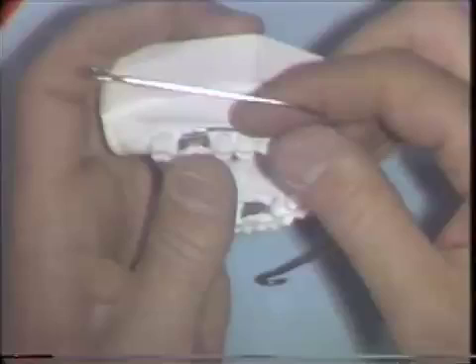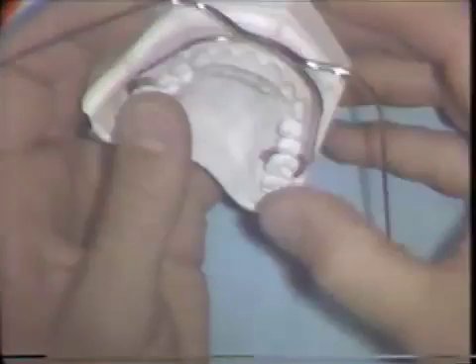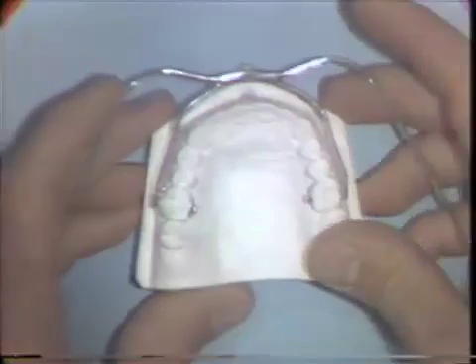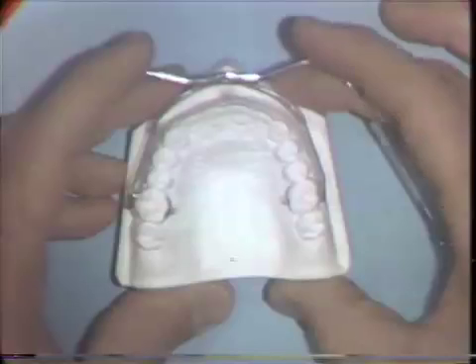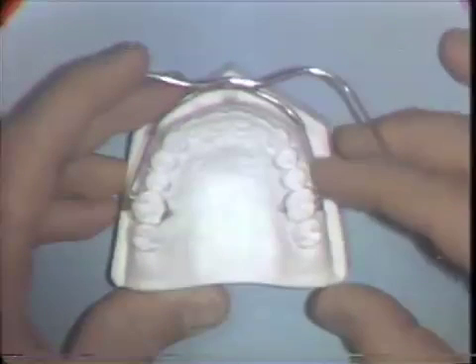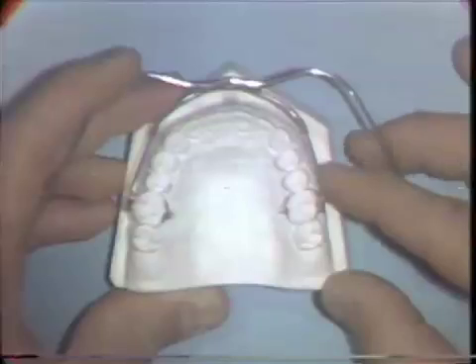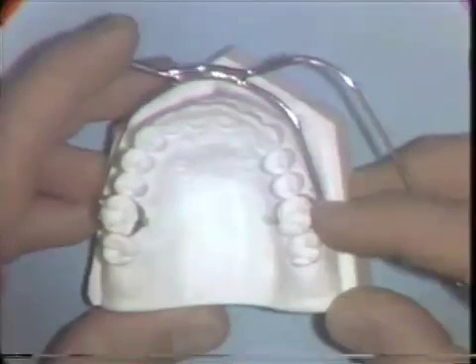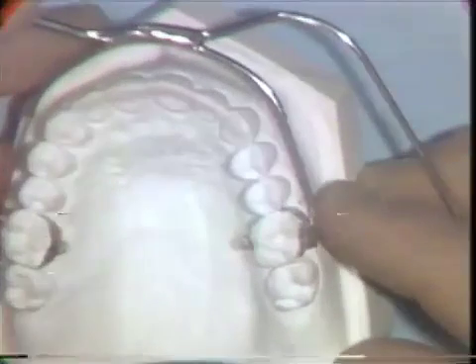The final product, Facebow, should be 5 to 6 millimeters away from the labial surface of the anterior teeth. It should sweep inward as it extends posteriorly to be 2 to 3 millimeters away from the bicuspid teeth. The bayonet bends should be small. They should be involving approximately 1/8 of an inch of wire.